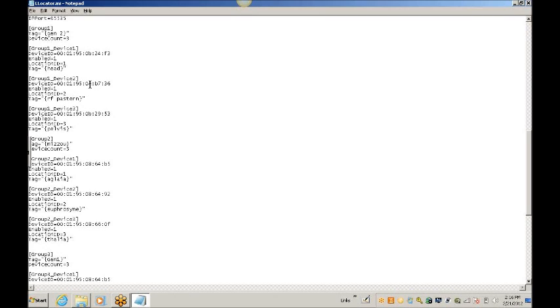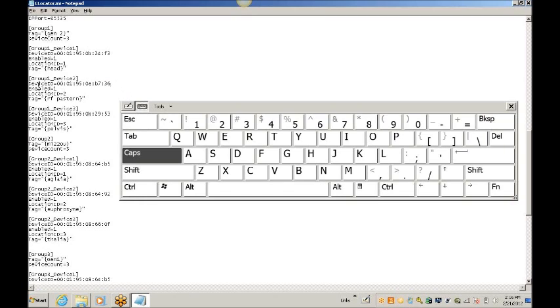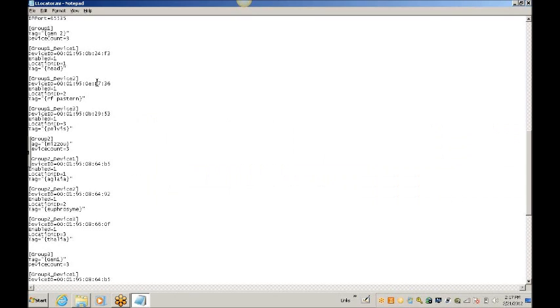Typically the first 6 characters will all be the same, so you'll be changing the last 6 or 4. It's easiest to just tap your cursor at the end of that number. This is the device ID line that we are changing, and you can just backspace through that and enter the new address. Be sure to include the colons in between each 2 characters. And in this case, I just changed the last 4 characters.